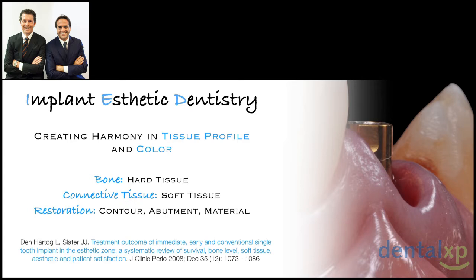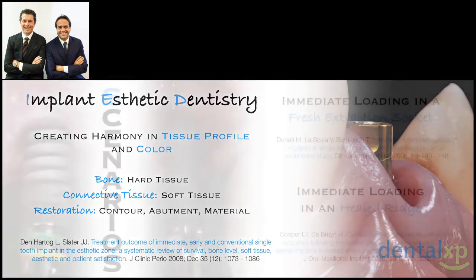all the parameters which are involved in this are basically the hard tissue, which is the bone, the soft tissue, which is connective tissue mainly, and we will discuss the importance of managing properly and utilizing the connective tissue, and also the restoration. So we will be discussing the prosthetic contour, the choice of the abutment, and which kind of material we have available today.